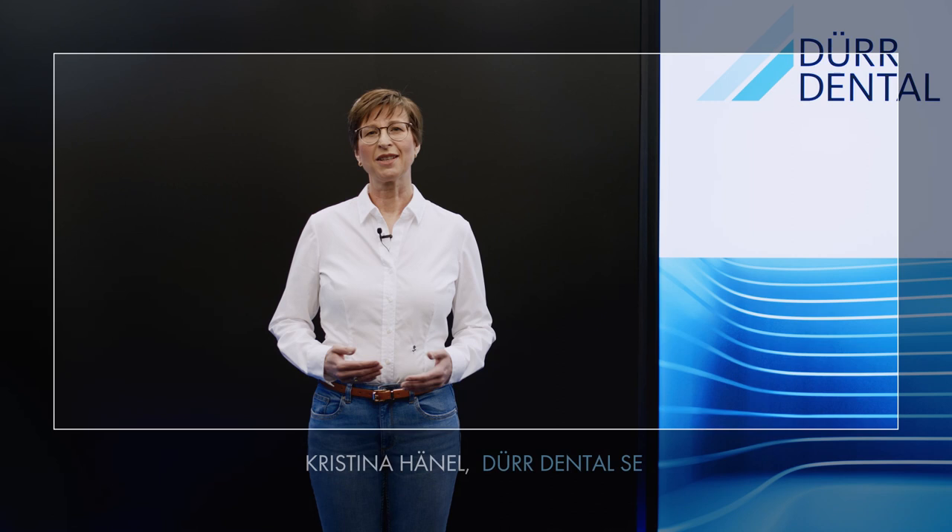Hello, I'm Kristina Haenel. Today I'm going to be presenting our MyLunos Duo combined device for ultrasound and polishing applications. The floor standing unit is the latest addition to the Lunos product family of prophylaxis systems from Durdental. It enables complete teeth cleaning using just a single device with highly flexible application tailored to the needs of the individual patient.